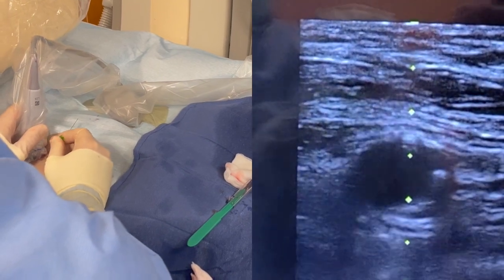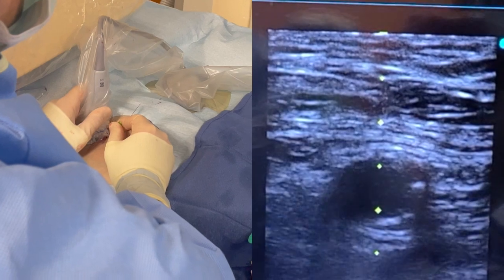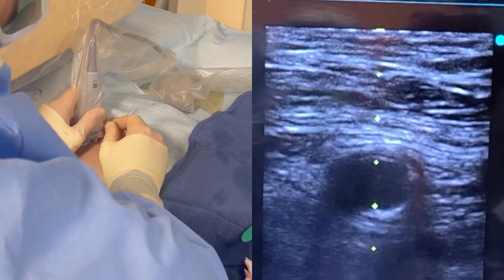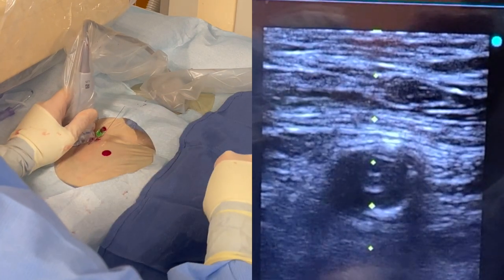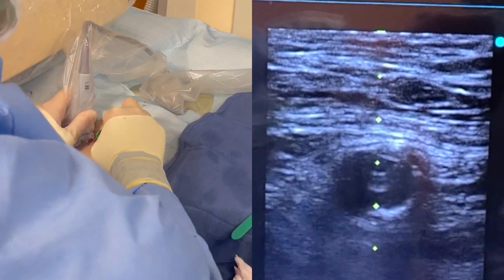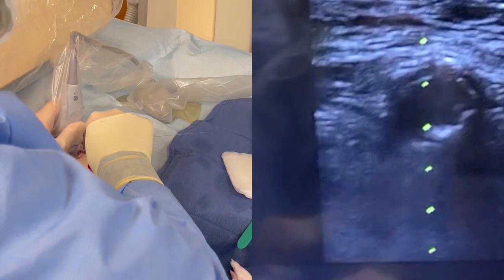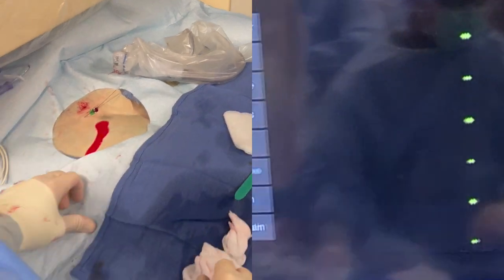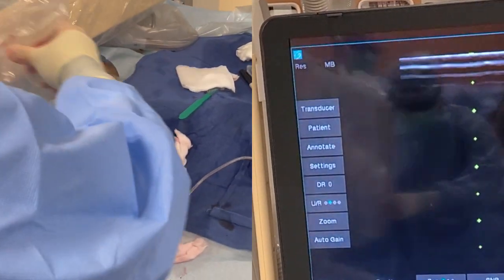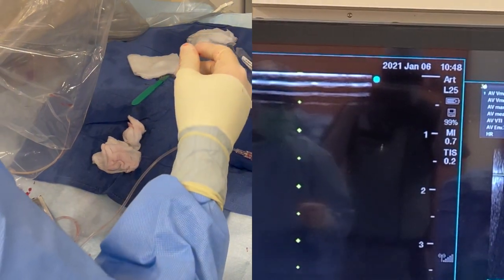As I advance the needle toward the artery, you can see it begin to tent. The needle is not seen on ultrasound until the moment it enters the artery in this case, and it has a very bright tip. This gives you confidence that you've done a single anterior stick and it's in the desired location. And again, use fluoroscopy to ensure that I've entered the artery over the femoral head.